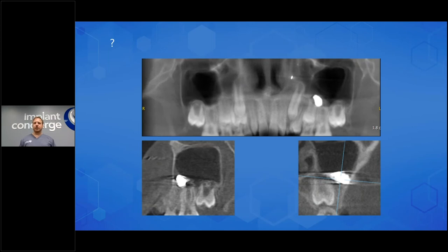And what's really crazy about it, and I shouldn't laugh, is that there was no soft tissue thickening. It's absolutely loose in the patient's head. So you have to imagine if they shook their head, they would probably hear rattling. But that was a really shocking find. Well, I'm sorry, I think I went a little too fast on the questions, because that's actually it.